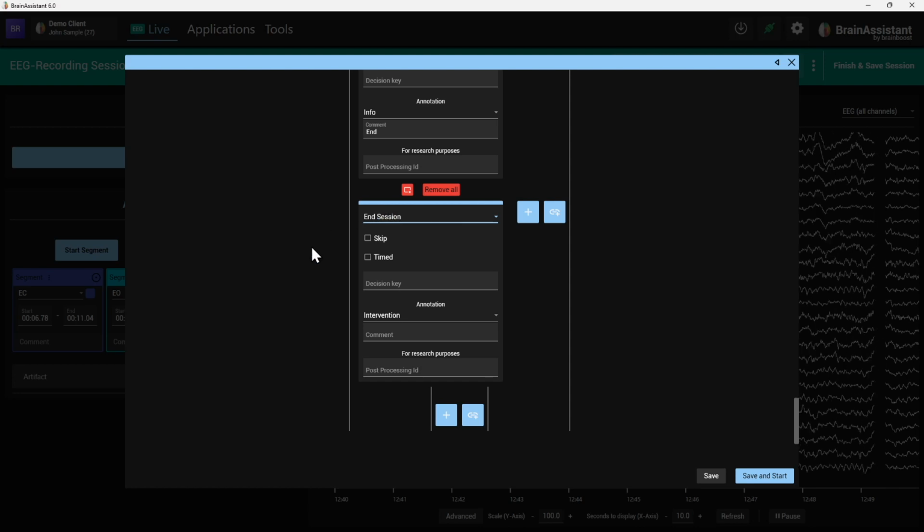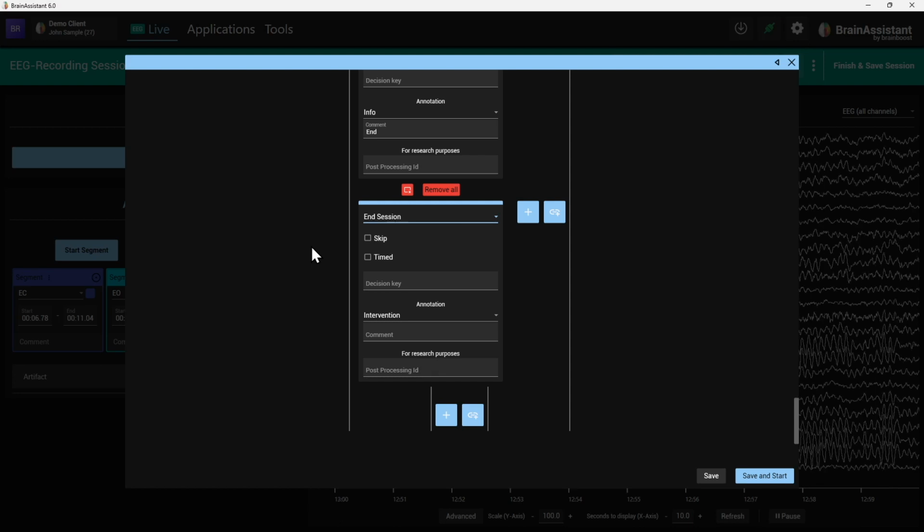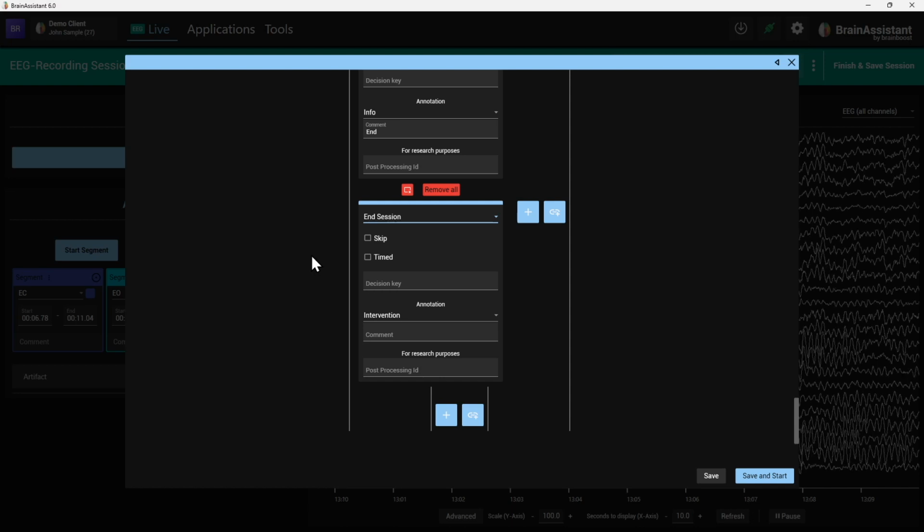This is what you usually do manually on the top right, correct? It will automatically do that for you, which is cool because when the flow is done, there's no weird data still recording that you forget about because you then say, please give me the Xbox controller, we're almost done. So it will end the session and save it, so you also don't forget to save it. But it might be shocking in the beginning when you say, oh my God, did it record? Did I forget to record?